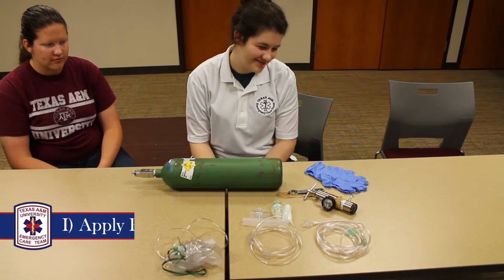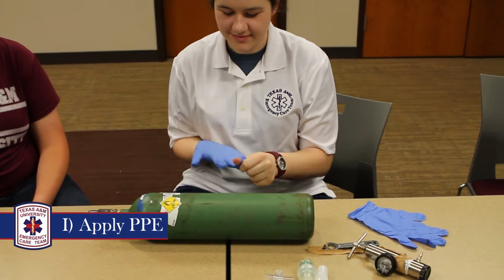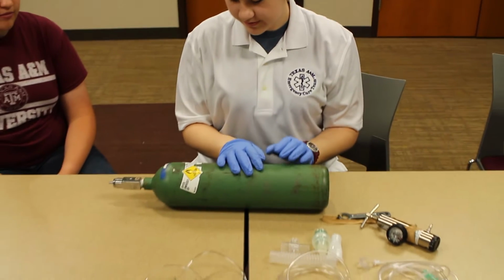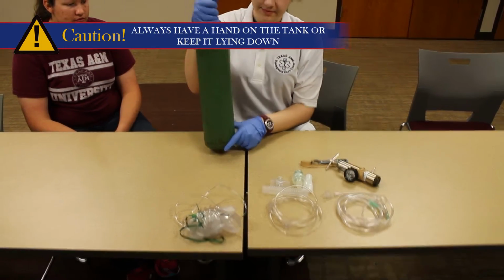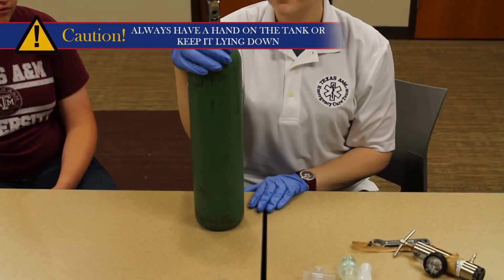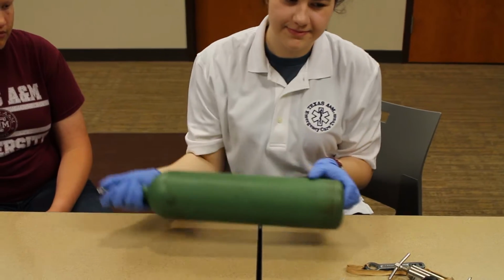Before you begin, always make sure the scene is safe and that you have your personal protective equipment on. Always take appropriate oxygen tank precautions. When it's standing upright, make sure you have a hand on it at all times, or lay it down on the ground or another flat surface.